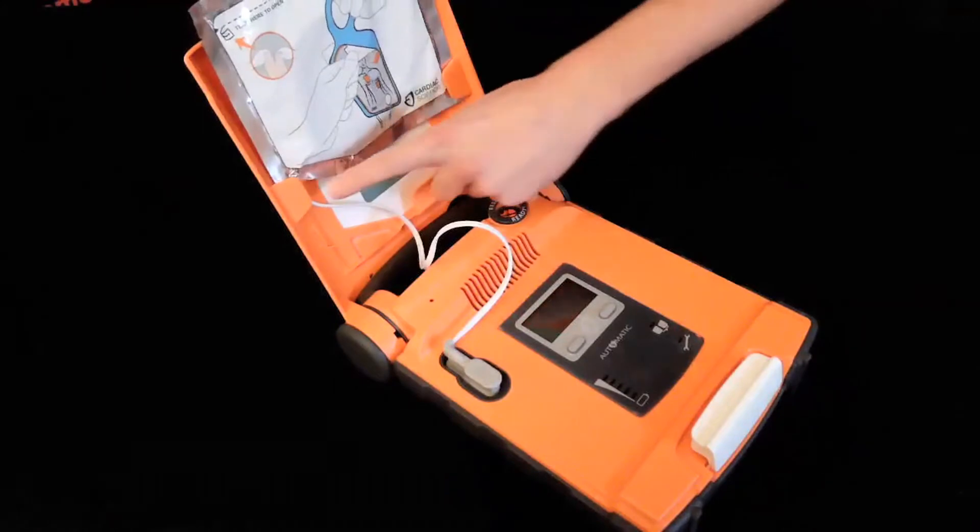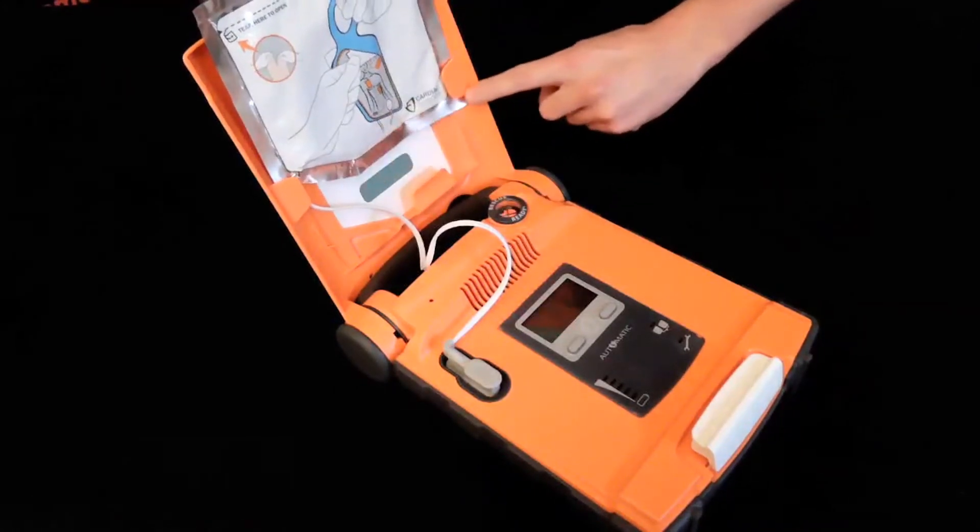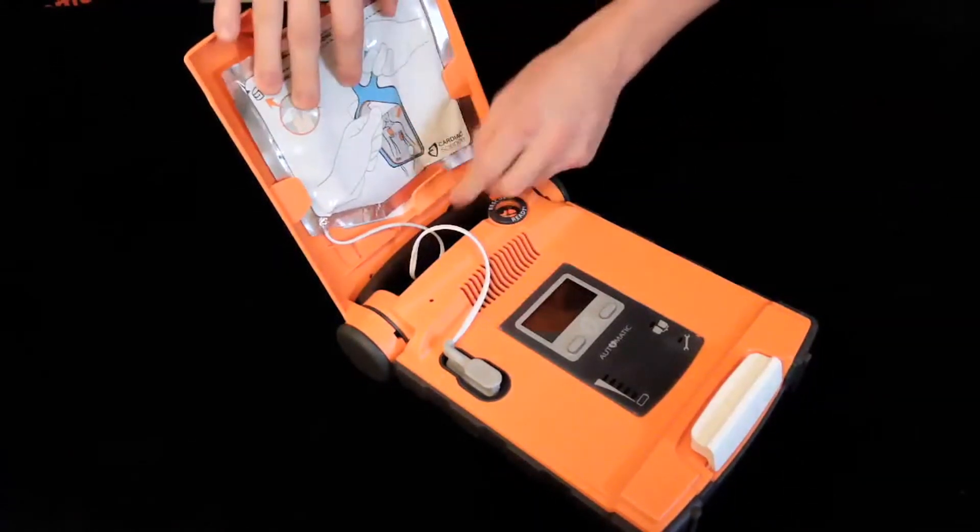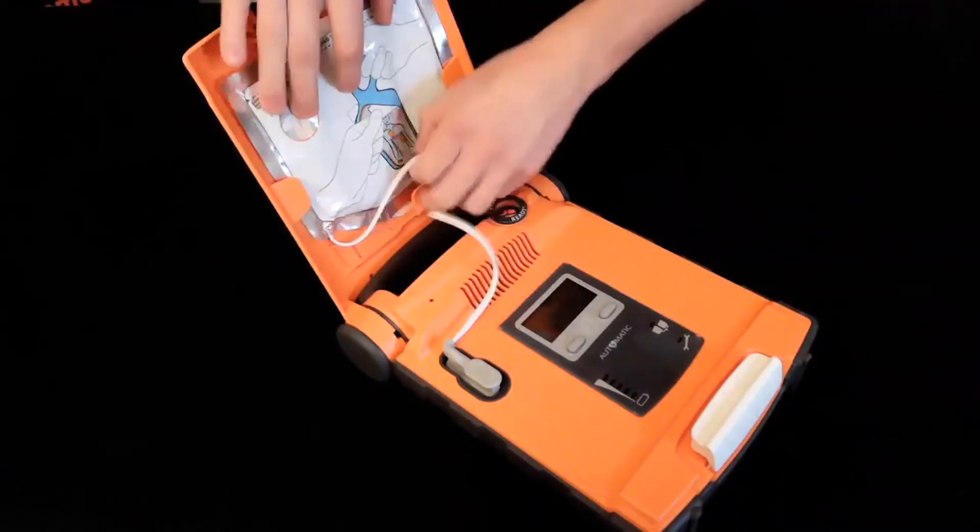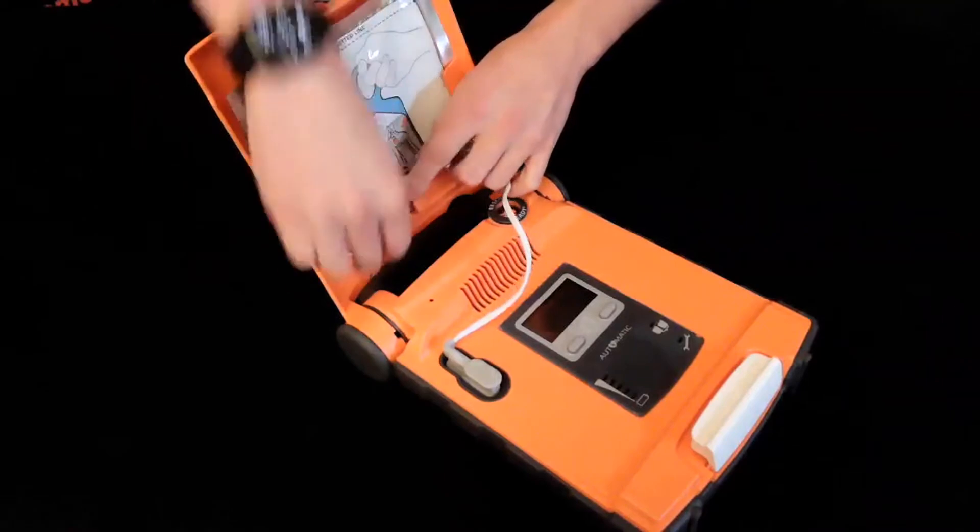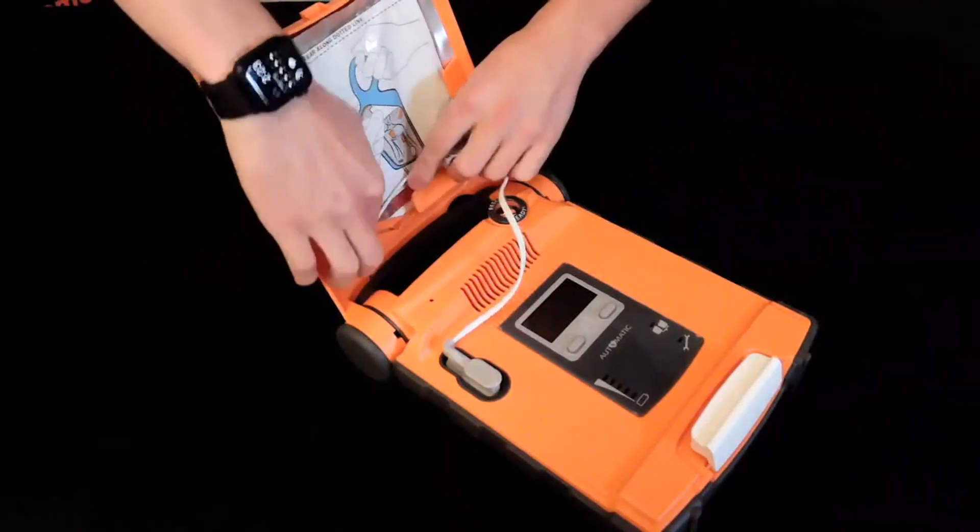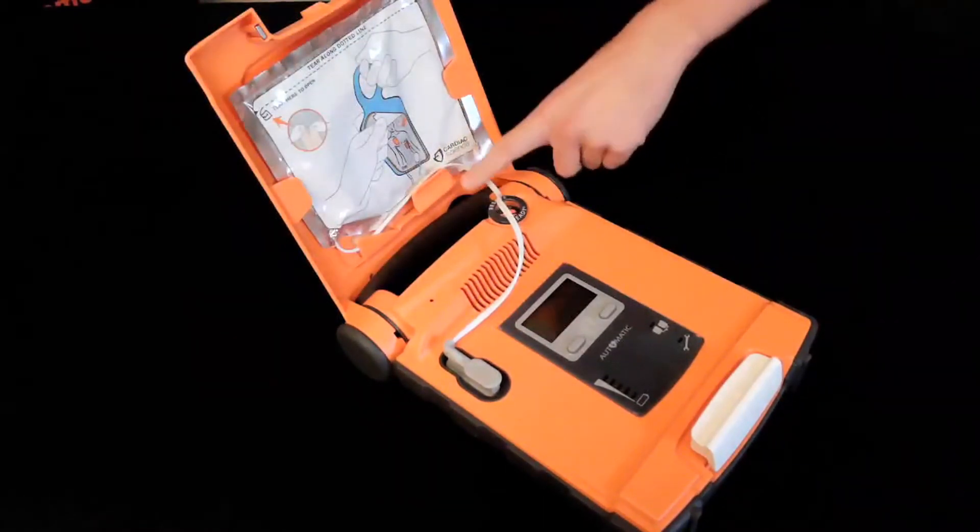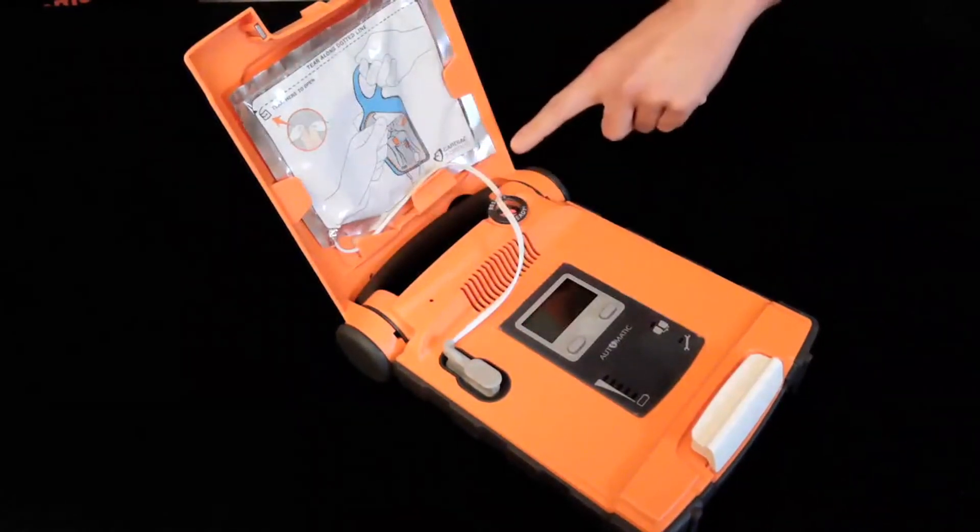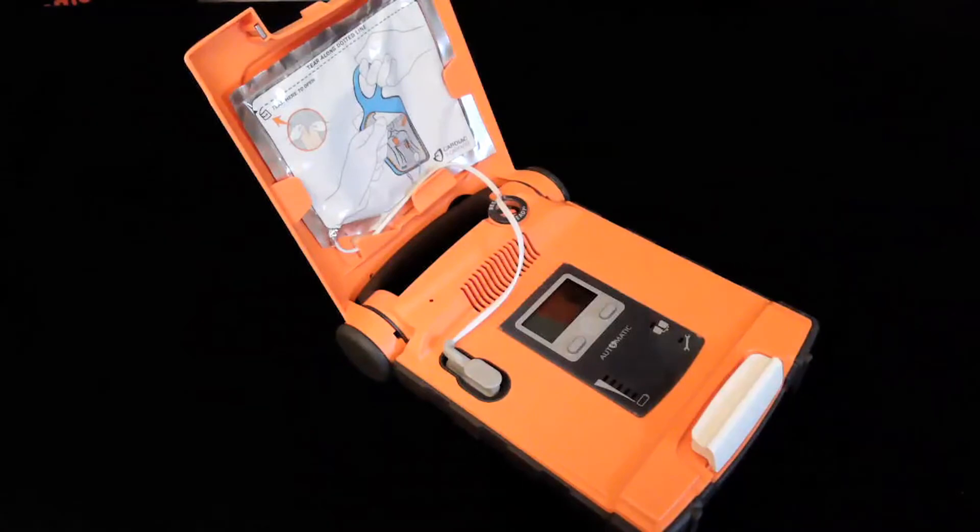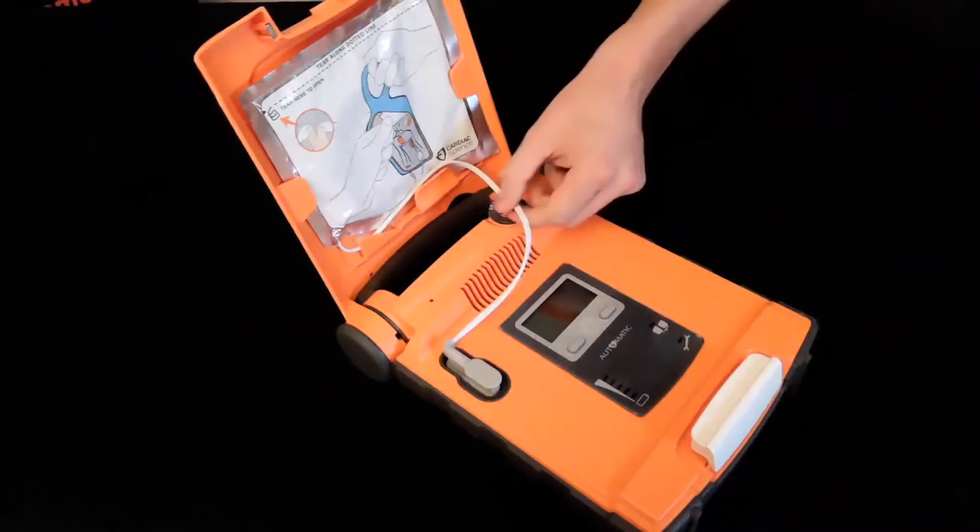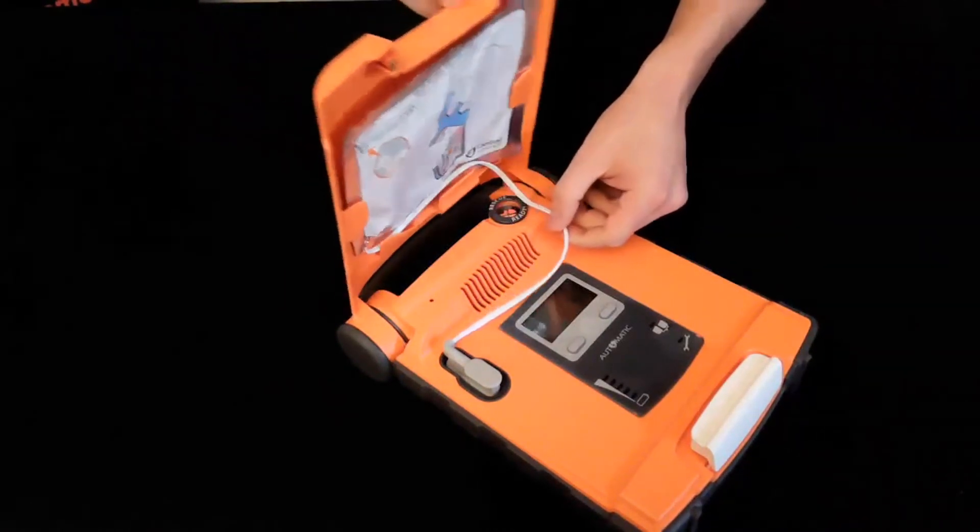Run the wire coming off of the pad through the guardrails on the bottom of the lid to avoid pinching wires once the lid is closed. Finally, close the lid to your AED.